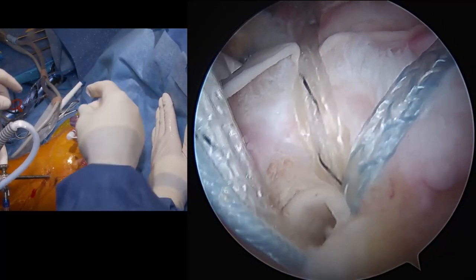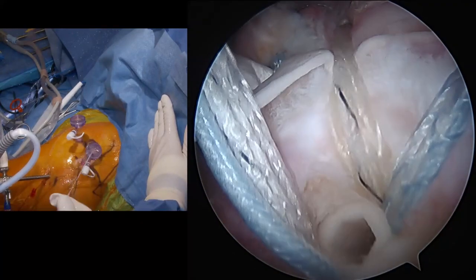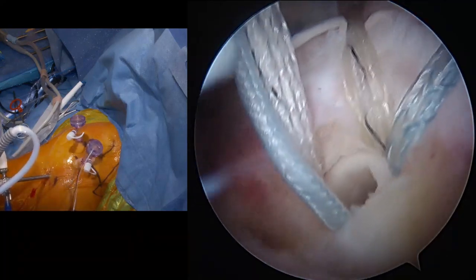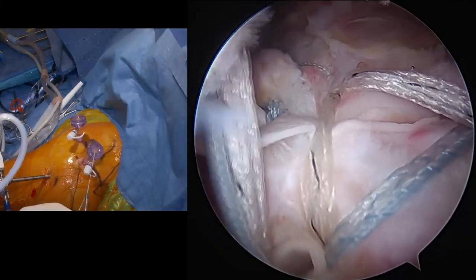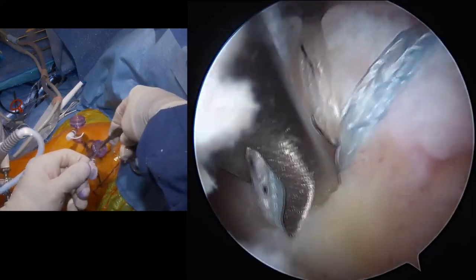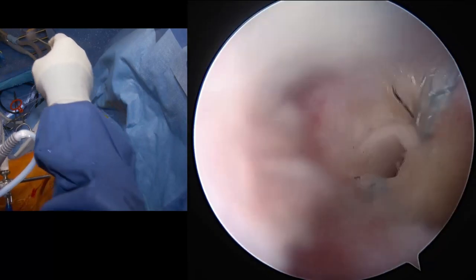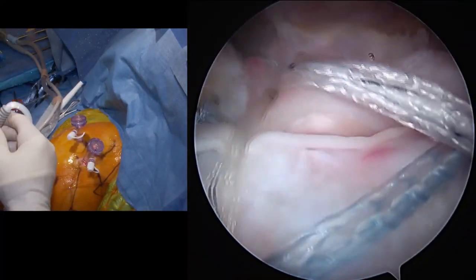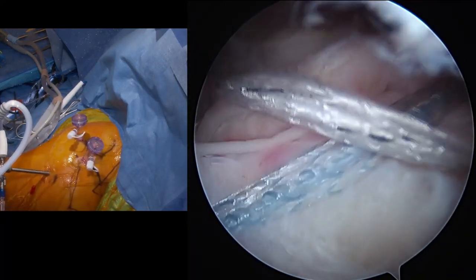Open-ended fiber tape cutter. If you've still got that, that's great. Thank you. Feed that through. Okay, out of there. Okay, good. So that's that. A nice solid repair at that front corner. Now we have to reinforce it with our double row. So we'll turn that back around a little bit. Let's have the fiber tape retriever.